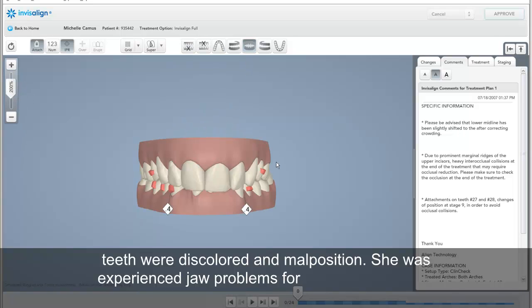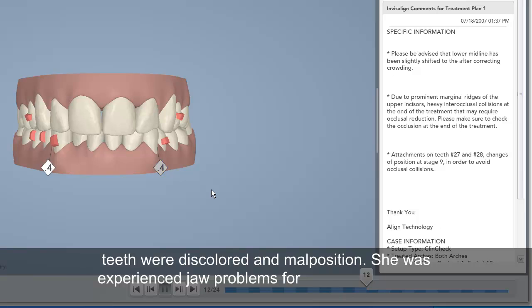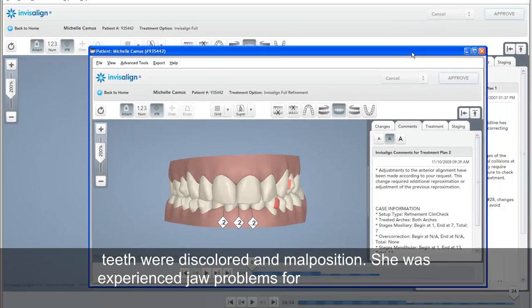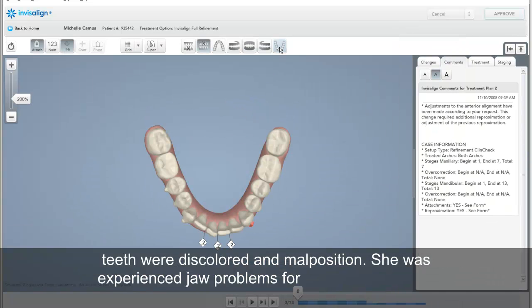You can see the Invisalign case, how we started, and that's how I've been playing. Again, of course, on the screen it looks pretty and beautiful, but it never happened like that in real life. So she came back to me for a refinement, and that's how we started a second stage of Invisalign. And let me show you what the bottom teeth look like.